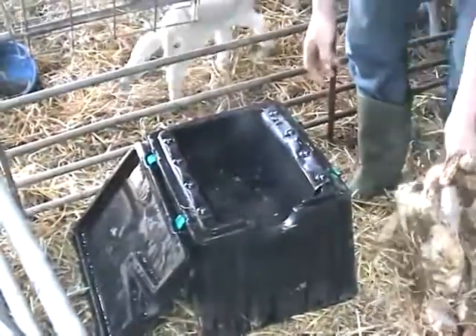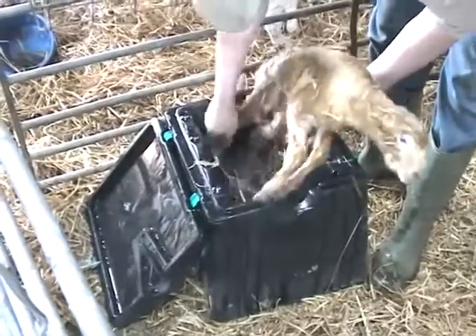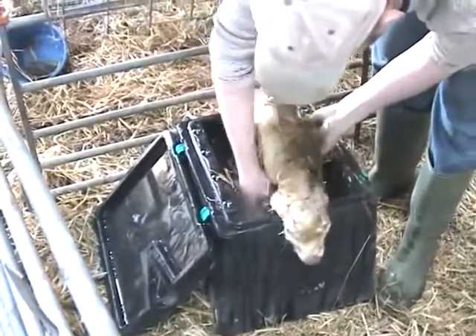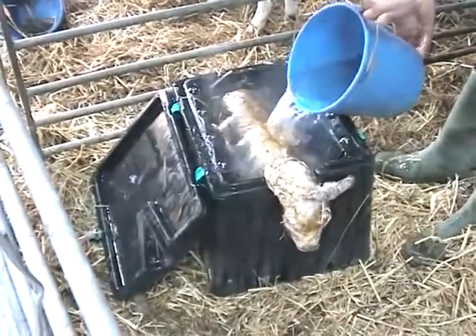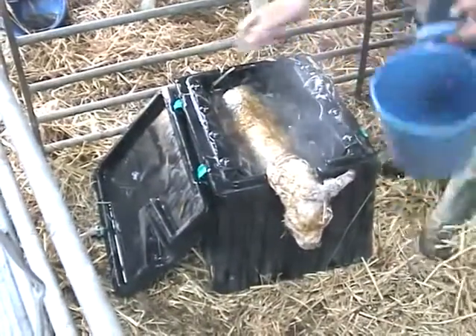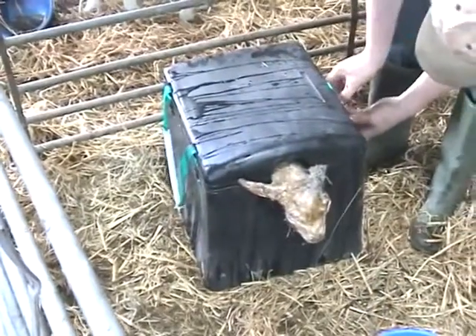The Woolly Warmer is extremely easy to use. Simply fill the vessel with warm water, place the weak lamb in the sling to hold it in an upright position, then top up with water to maximise coverage of the body. Replace the lid, holding the lamb's head securely out of the water.